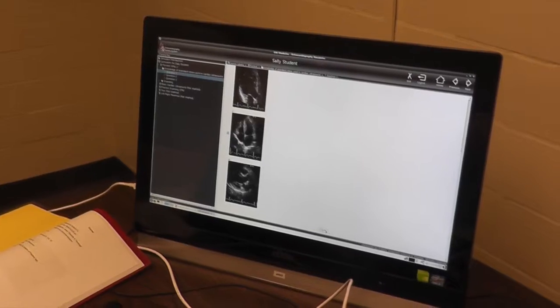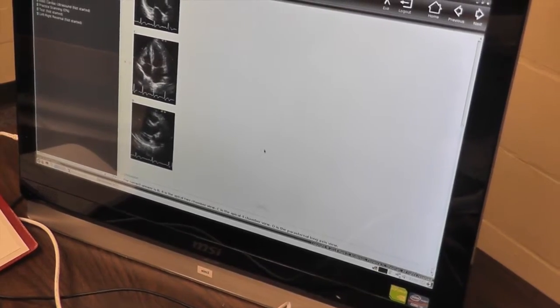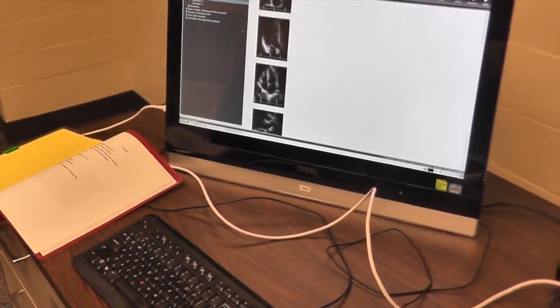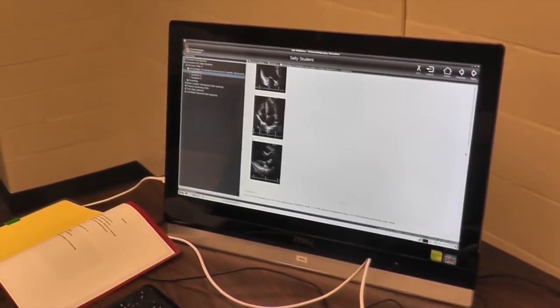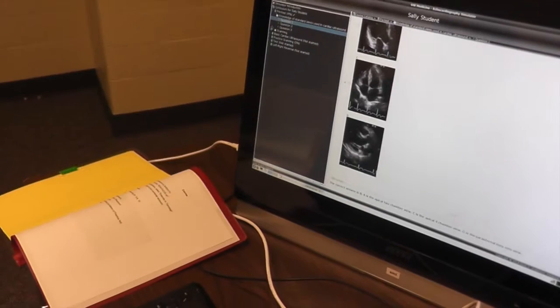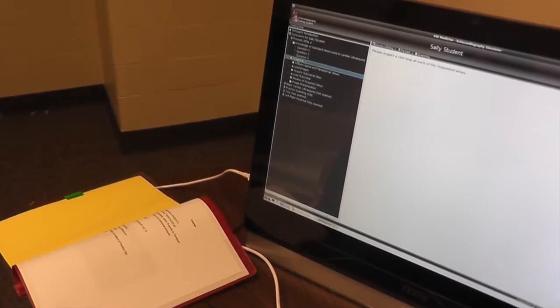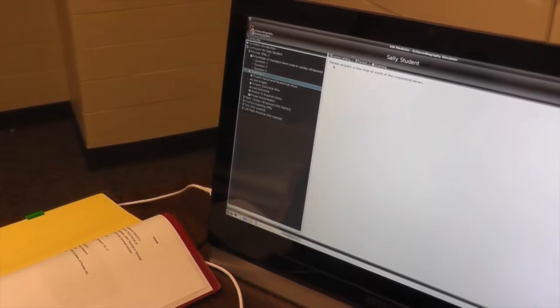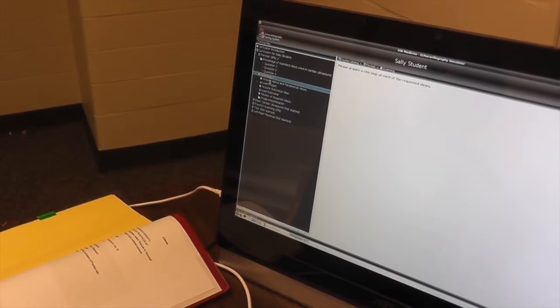And then you hit the submit button to send your answer in. Proceed through the 3 questions and then go to scanning the mannequin. Again, specific instructions will be provided as you go through.